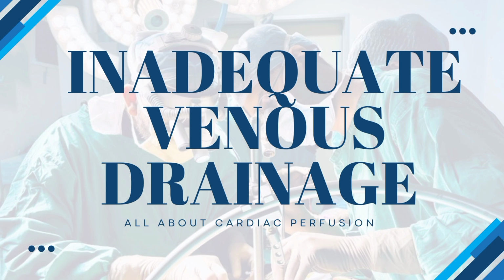What is inadequate venous drainage? In simple terms, inadequate venous drainage refers to a poor or insufficient removal of deoxygenated blood from the patient, especially in the SVC, IVC, and the right side of the heart. This causes blood pooling, tissue congestion, and if not corrected, serious complications like edema, hypotension, lactate formation, and even necrosis.